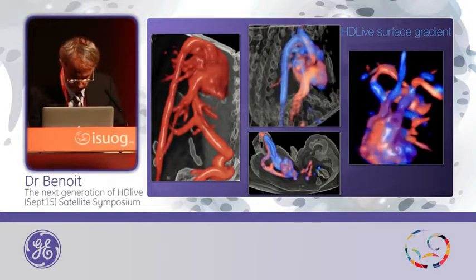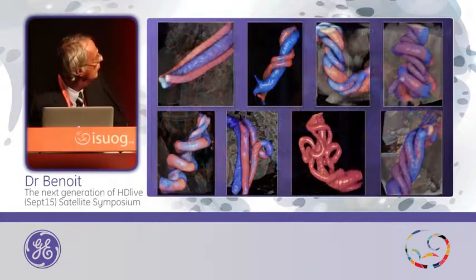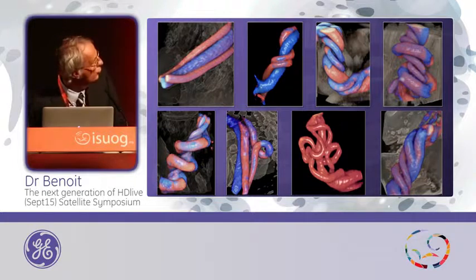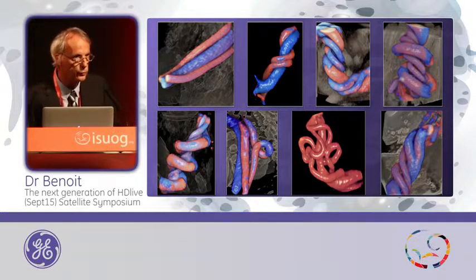But I will show you some umbilical cord. Look at all this umbilical cord. The normal and usual aspect of the umbilical cord is this one and this one. But sometimes you have this, sometimes you have a loop of an umbilical cord, sometimes you have many loops of umbilical cord. And in this case, the vein was dividing in two veins. You can see here the two veins. And this one was strange, but it was the same fetus. On one part of the umbilical cord, the cord was like this, and on the other part, it was like this.